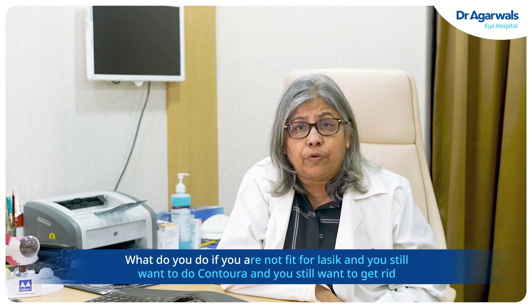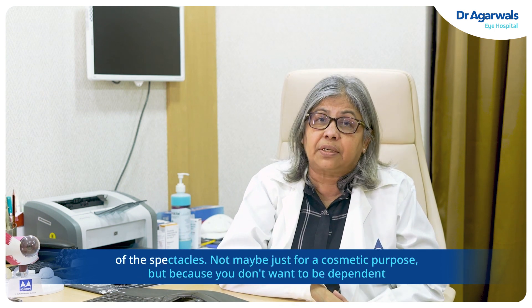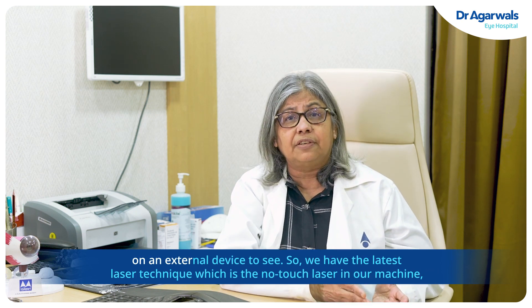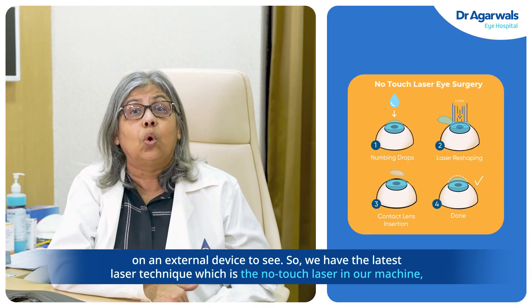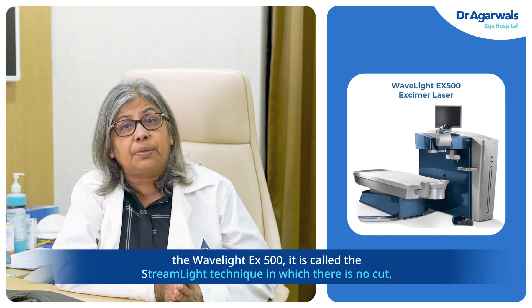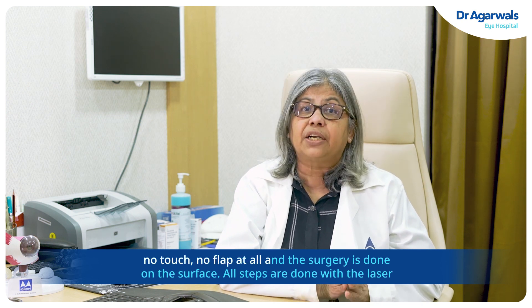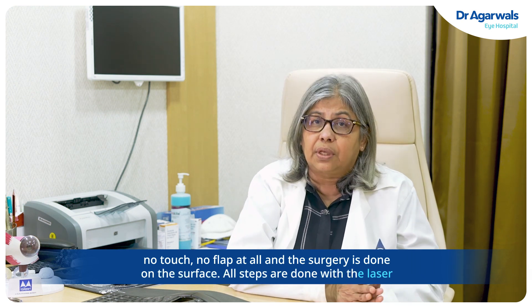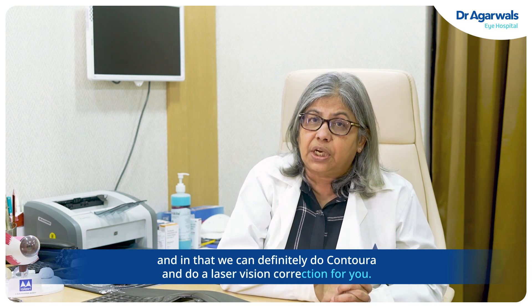What do you do if you are not fit for LASIK but still want Contura and want to get rid of spectacles — not just for cosmetic purposes, but because you don't want to be dependent on an external device to see? We have the latest technique of laser, which is the no-touch laser. In our machine, the Wavelight EX500, it is called the Streamlight technique, in which there is no cut, no touch, no flap at all, and the surgery is done on the surface. All steps are done with the laser, and we can definitely do Contura and provide laser vision correction for you.